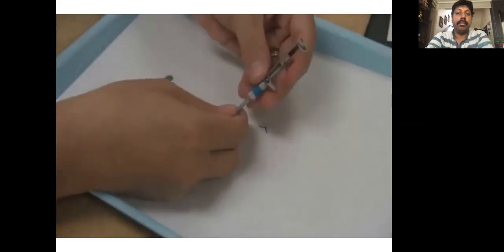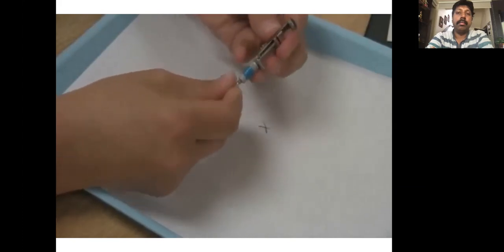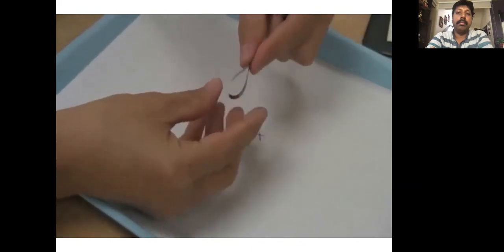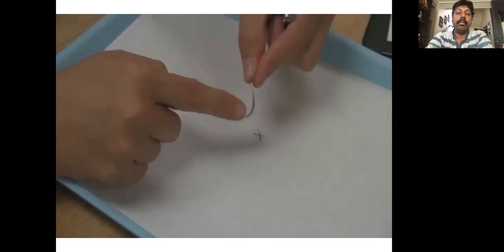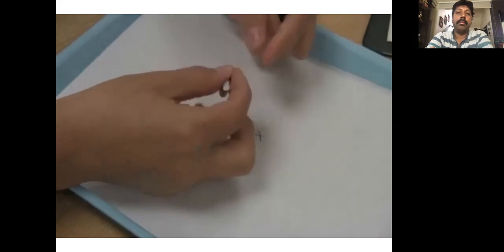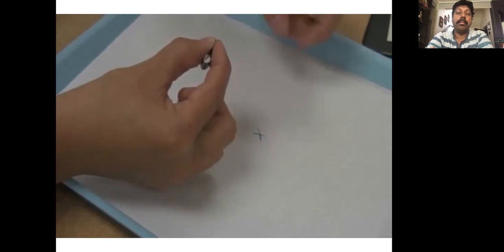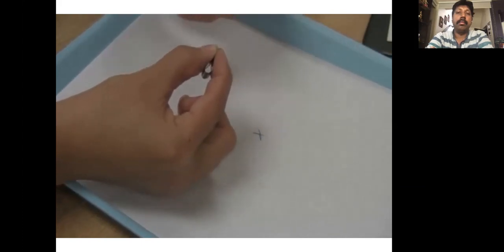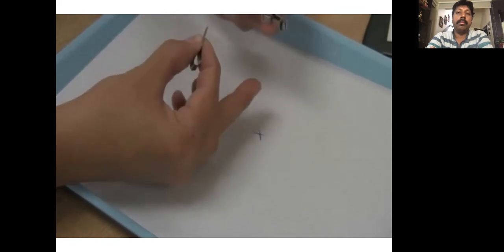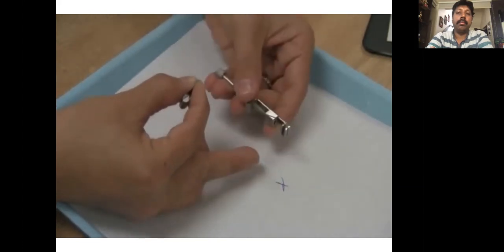To place your Tofflemire band together, take your band and fold it in half. You want to ensure that the small circumference is facing up. Grab your fingers and hold the Tofflemire again, so the small circumference is facing up. You also want to hold your retainer so that the outer slots are also facing up, not down, up.